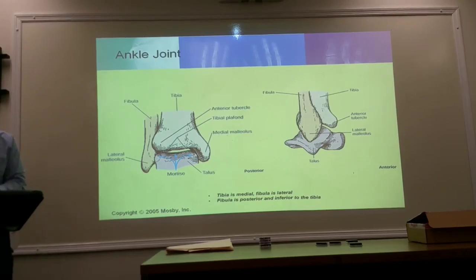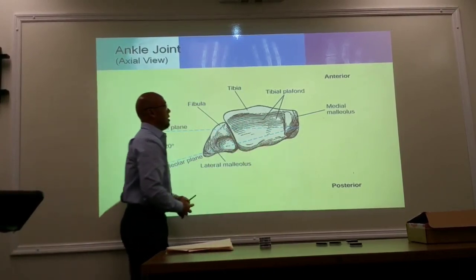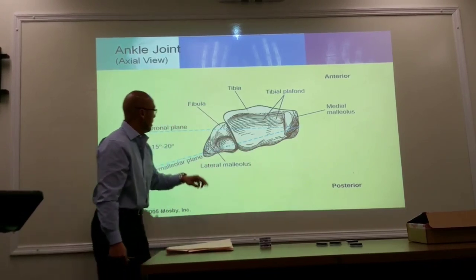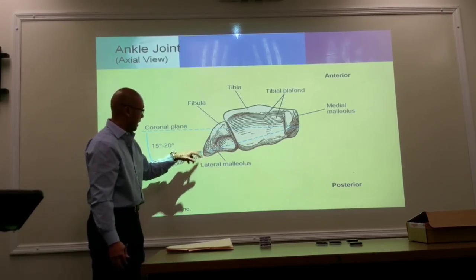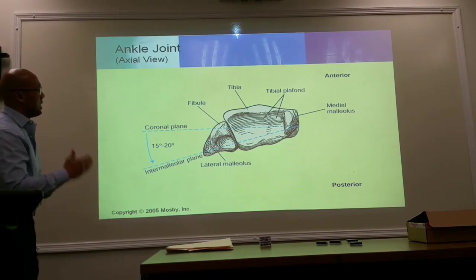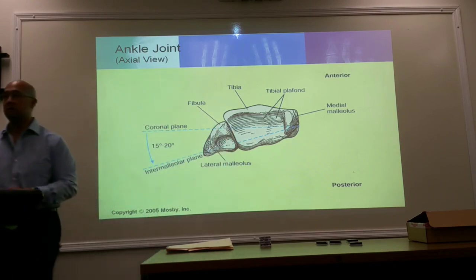Okay, so that's the bottom surface of the tibia. This is the smooth surface here. Then you have the bony projection, where this is the medial malleolus. You have the bony projection on the fibular side. This is known as the lateral malleolus. Okay. So now we're looking at the space between the tibia and the fibula, the joint space.